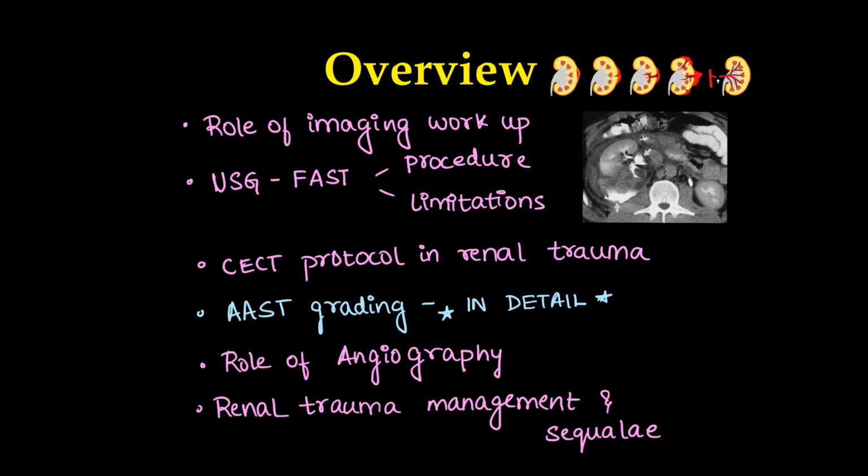We'll discuss it under the following headings. First, the role of imaging workup in renal trauma, then in detail about the USG FAST procedure and its limitations, the CECT protocol in renal trauma, then the most important part of the topic, AAST grading, that is the recent update of 2018 in detail, and the role of angiography, management and sequelae in cases of renal trauma. This we'll discuss in this video.